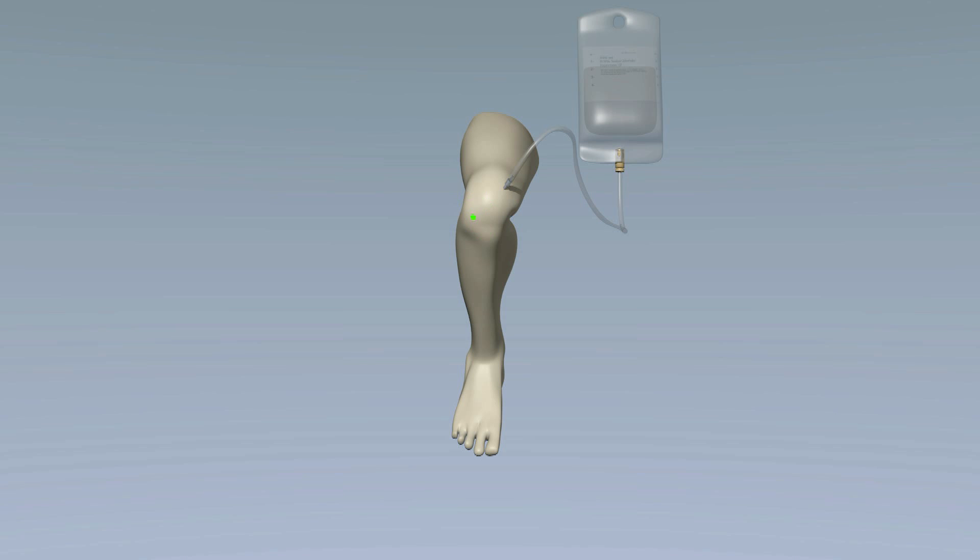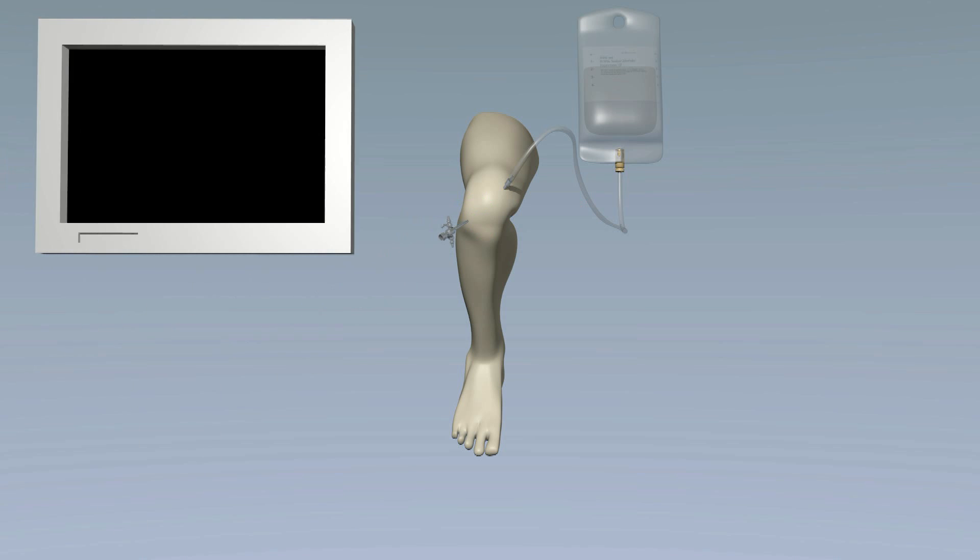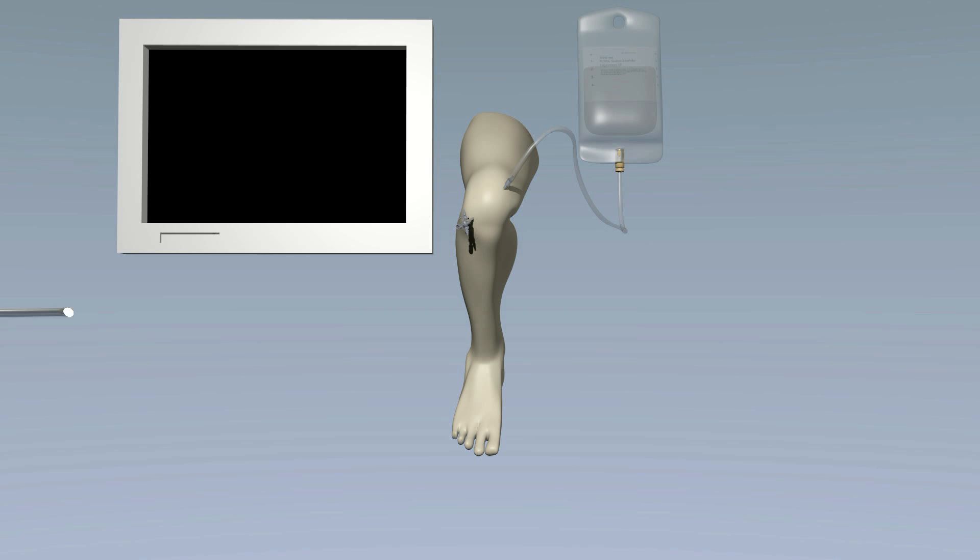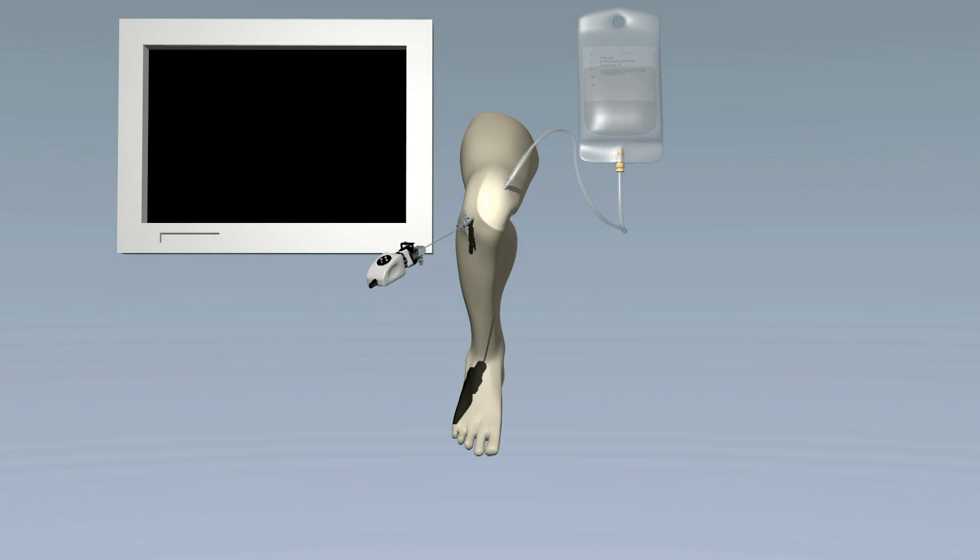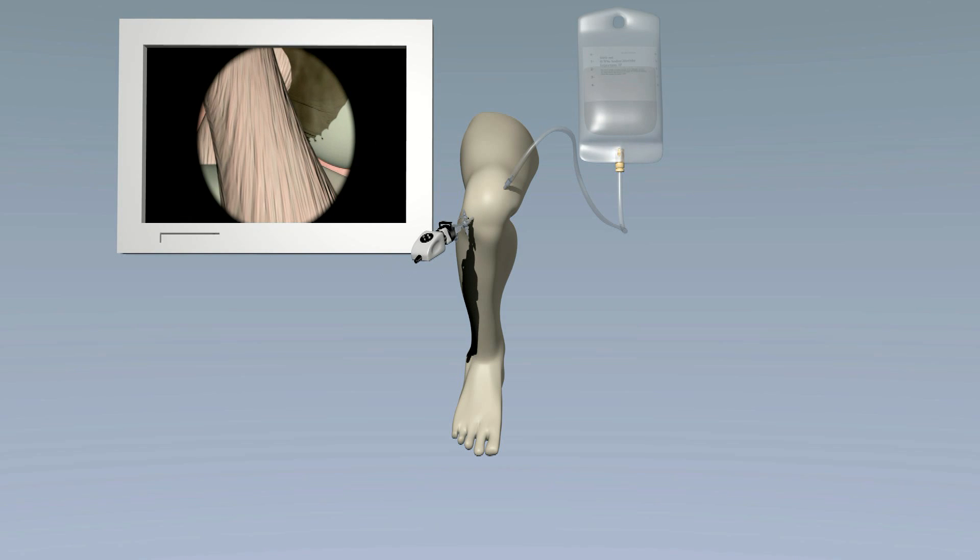One incision becomes a portal for the camera. The camera is long and slender which makes it easy to fit through the portal. Fiber optic cables carry the signal from the camera to a monitor. The surgical team can then view the inside of the knee joint on the screen.